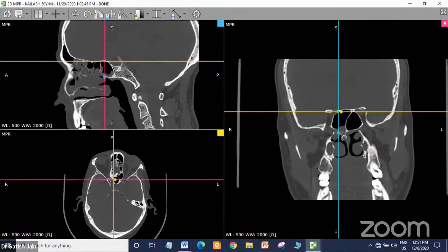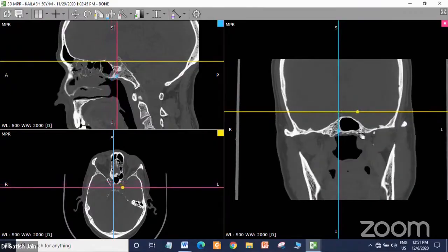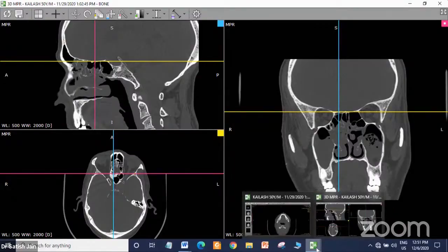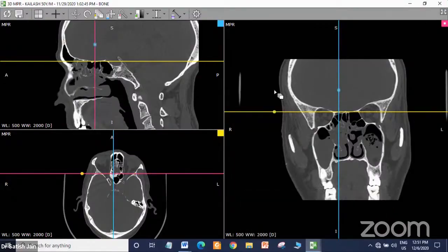Dr. Satish, one message to juniors: those who are not very conversant in understanding radiology, it takes good time. Somebody asked about the DICOM software that can be downloaded. A free version is available on Google. And they must sit with the radiologist on the console and try to understand with him for the beginning. Is that the correct approach? Yes. Once you start acquiring your data on DVD, with this software only you can understand the entire radiology in all planes.